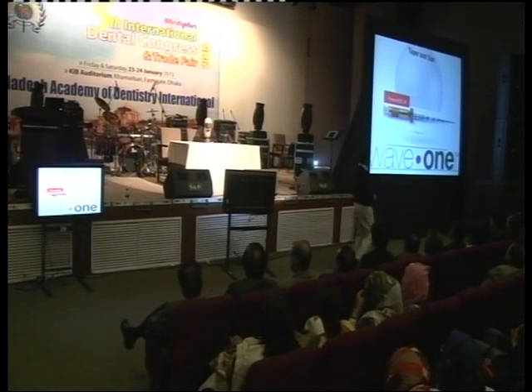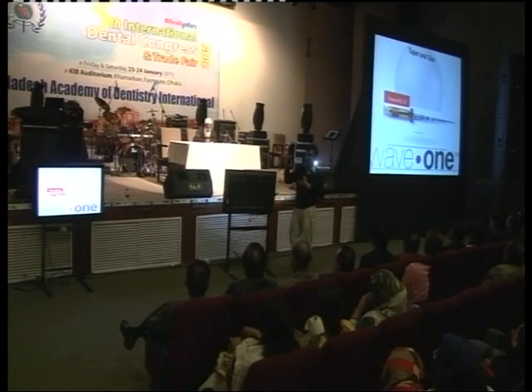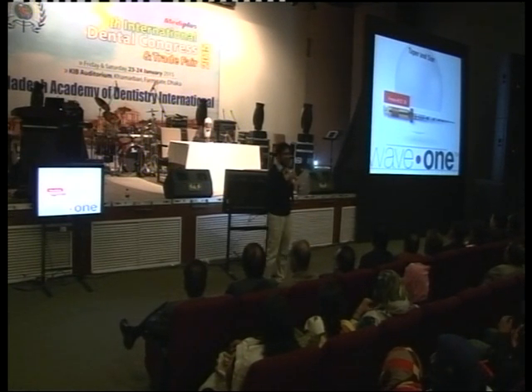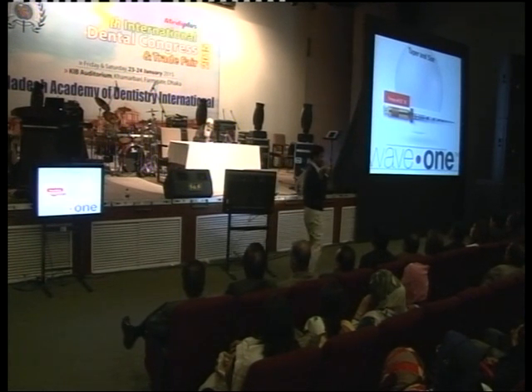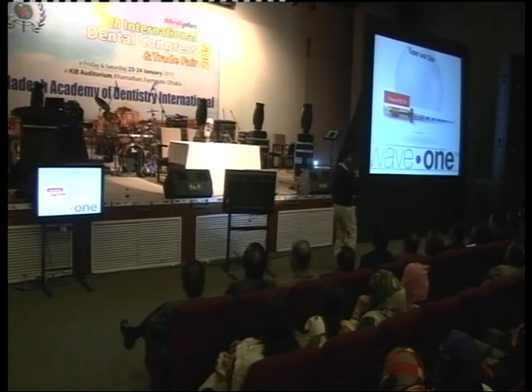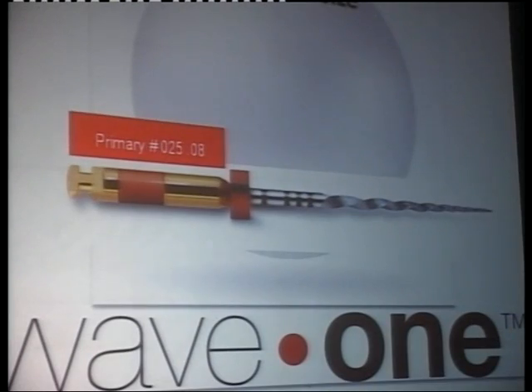And this is the primary file. This file is used for most canals, except the small canal and the large canal. They have defined the small canals here as those of the mandibular anterior teeth, the mesiobuccal canal, and the mandibular incisor teeth. These canals are considered small. And large canals are the distal canal of the mandibular molar, the palatal canal of the maxillary molar, and the single canal premolar. Apart from these, you can treat all the canals with the primary file.